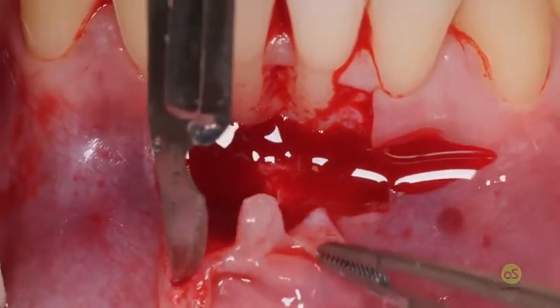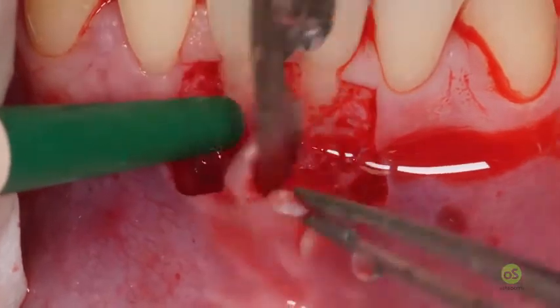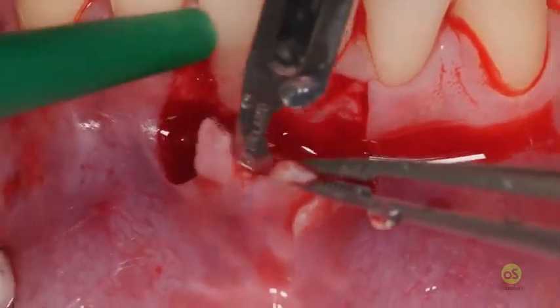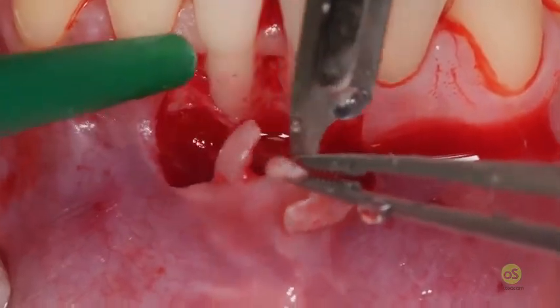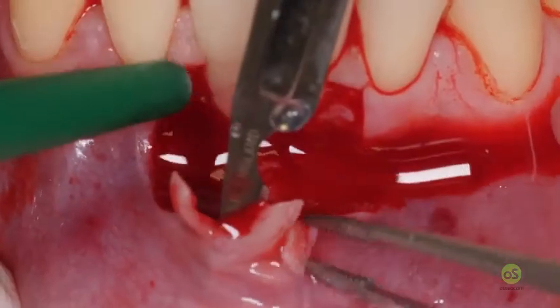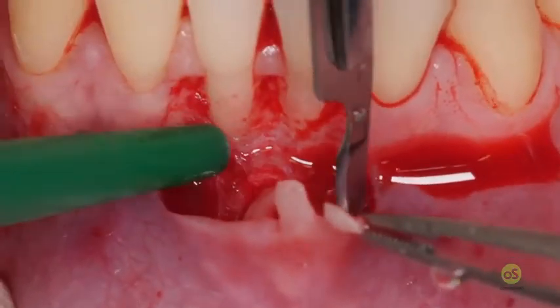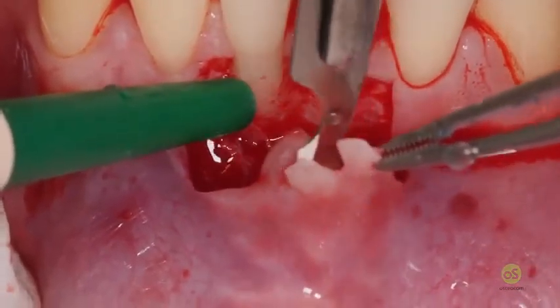Now the flap is made of 3 papilla but also 2 vertical release incisions. And this alveolar mucosa, despite the presence of many scars here, you see, this is the scar.